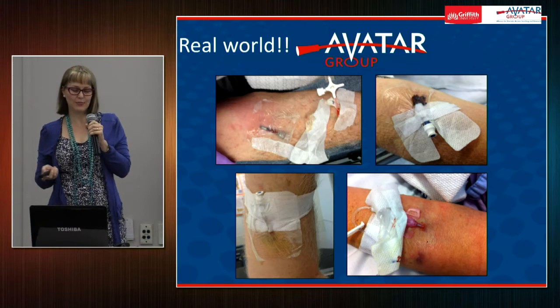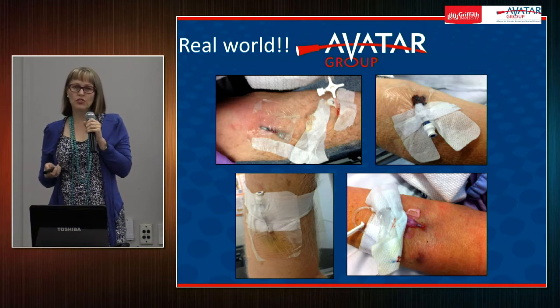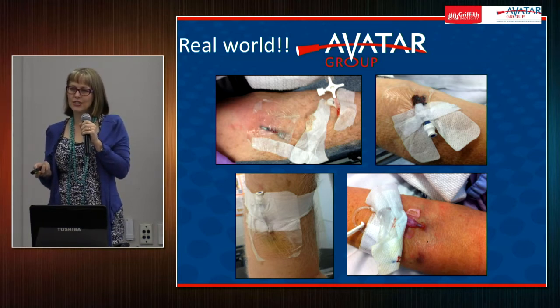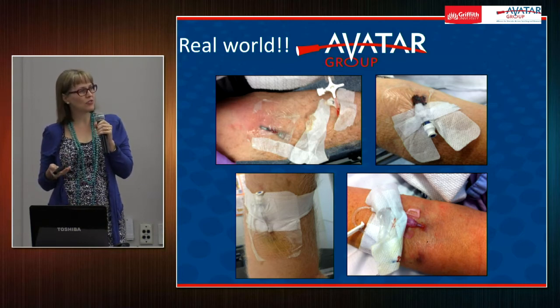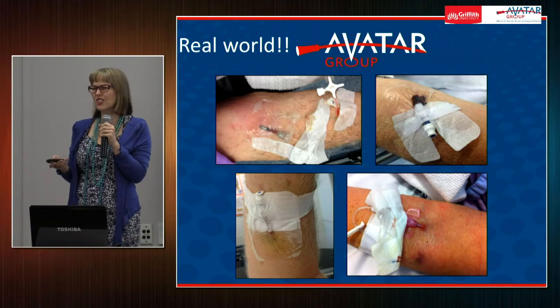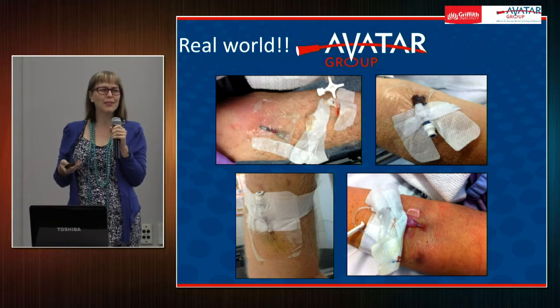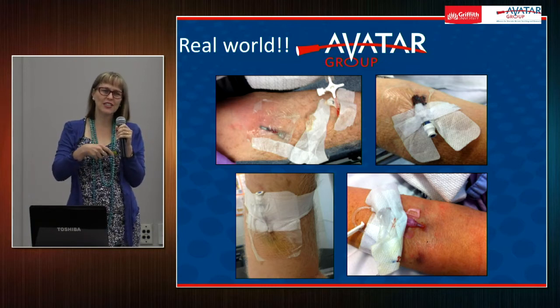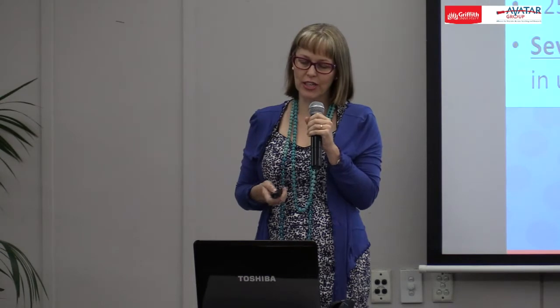This is what we see in our hospitals all the time, and I'm sure if I walked around your hospitals I might see a few of these too. Traditionally, because we have taken PIVs out after just a few days, or they stopped working after a couple of days, nurses aren't really in the mindset of doing dressings. With central lines, we know we've got to do it weekly and we document that, but with PIVs we kind of think, oh, it's going to come out anyway, so it's not really in our historical practice to do PIV dressings. And I think maybe that's why when we see dressings like this, we just ignore it, or we put a bit of extra tape on, don't we? A lot of non-sterile tape, which actually usually falls off within 24 hours anyway. So it's a bit of a fix, but it doesn't generally last.